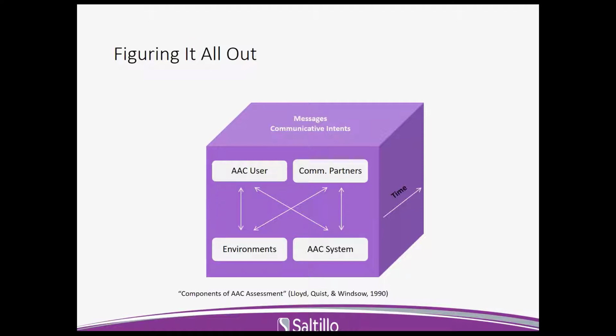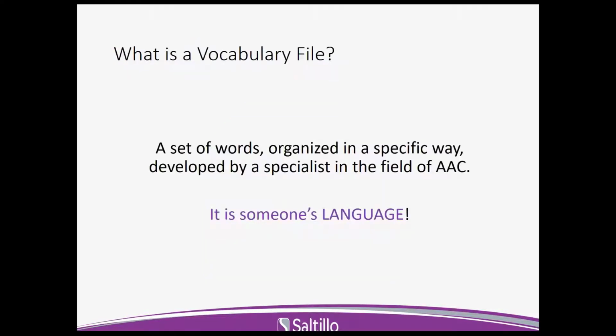So, what we are going to focus on today is one part of the AAC system, and that is the vocabulary file. A vocabulary file is a set of words organized in a specific way, developed by a specialist in the AAC field. It essentially is someone's language.